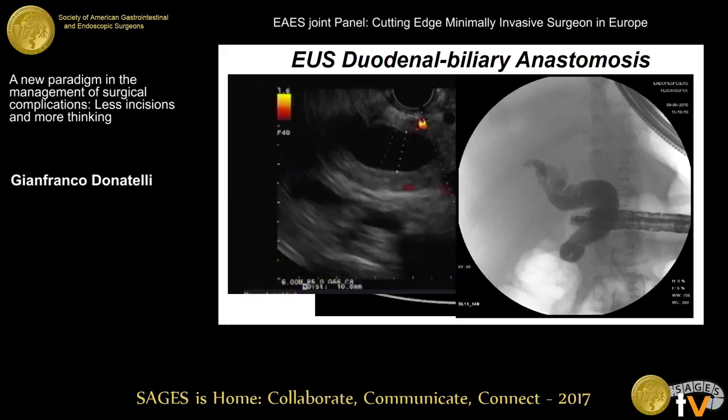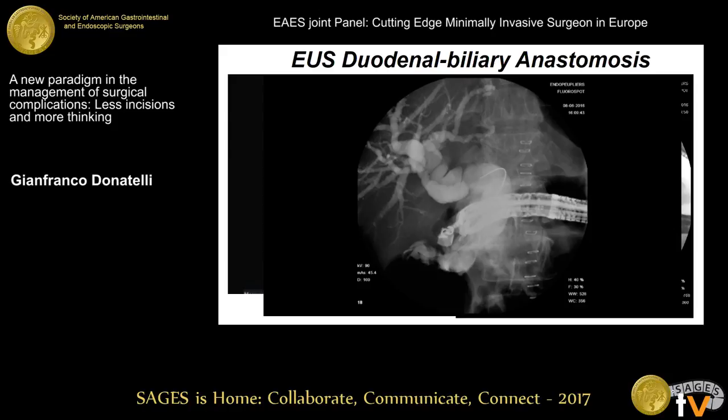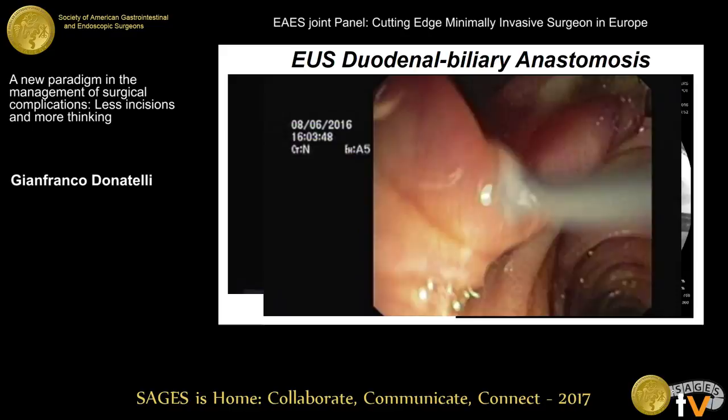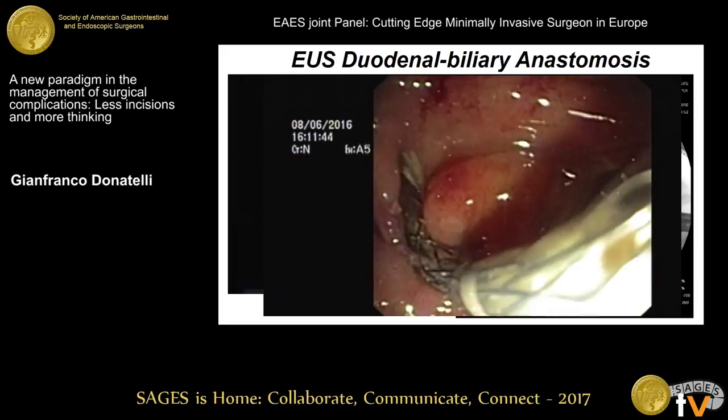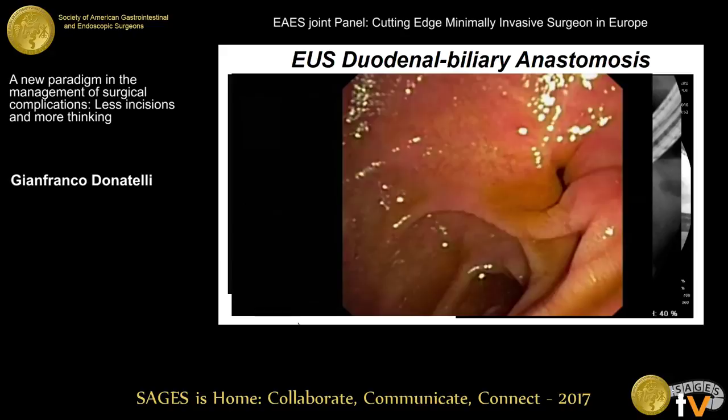And fistulotomy, I made the fistula in the duodenum and the CBD behind. Guide wire, and then stent. I grasp, I insert, then by percutaneous, I insert, I feel, I got the wire in the liver, because with my wire, I went all the time into the cystic stump, which had a very low insertion, and then I deliver the stent. And this is the result now in these patients. You can see, this is an anastomosis, a bilio-duodenal anastomosis.